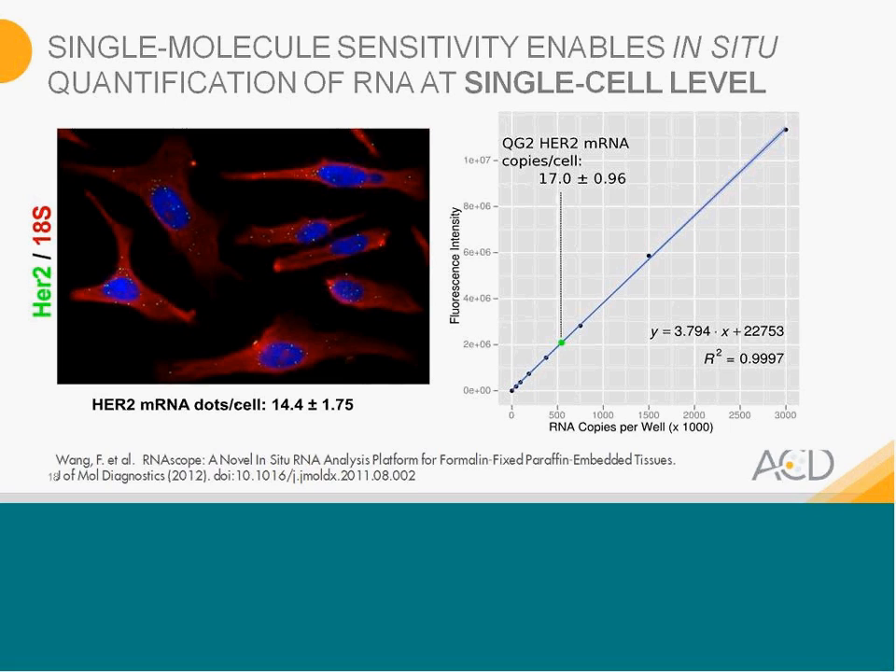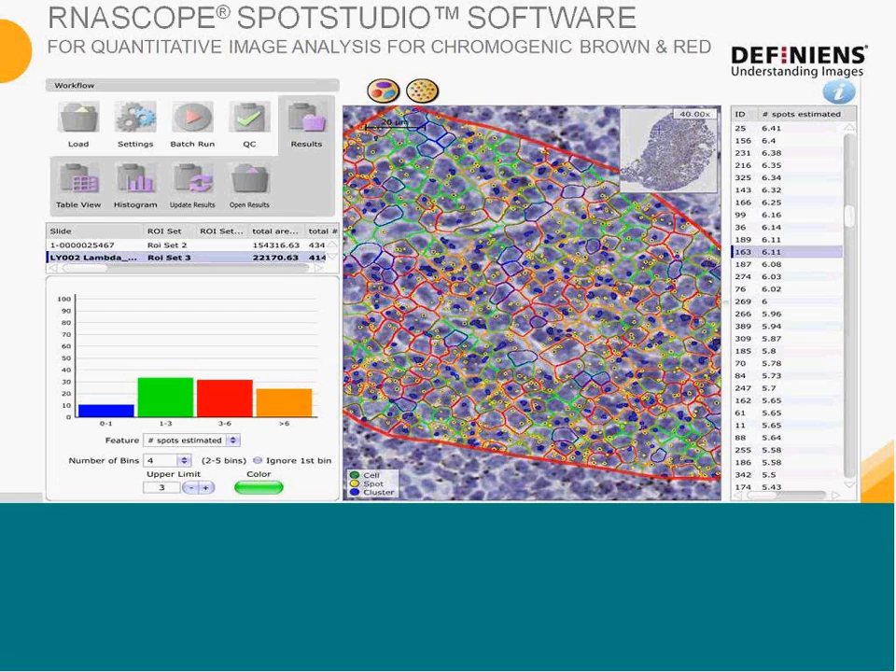In everyday use, it would be painful to quantify manually. So we have worked with a company called Definiens, and they have developed their software to work with our assay. For chromogenic brown and chromogenic red, you can use RNA Scope Spot Studio software to automate this quantitation process. The software identifies each cell and also bins each cell into different levels of expression, giving a number of spots estimated per cell.